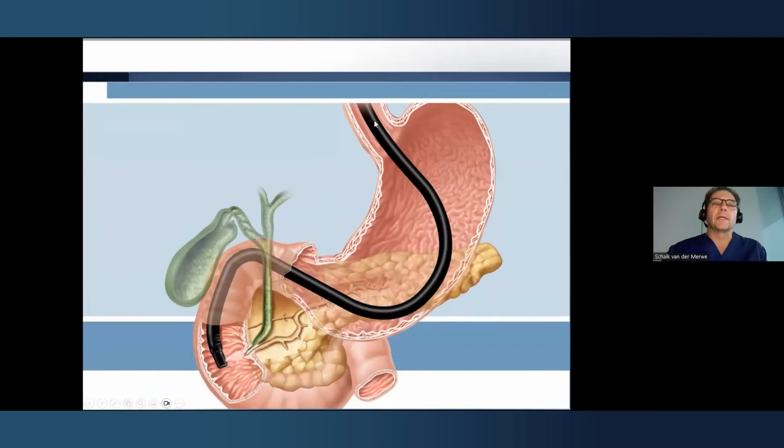So I don't have to preach to the converted when I say that endoscopic ultrasound has really revolutionized the field. Both diagnostic and therapeutic EUS now form part of the armamentarium of the endoscopist that he can offer to manage patients better. With EUS, we can access previously inaccessible regions of the gastrointestinal tract, and by placing the echoendoscope in close proximity, we can visualize structures like bile ducts, the pancreas, the liver, the gallbladder, in order to perform diagnostic and therapeutic procedures.